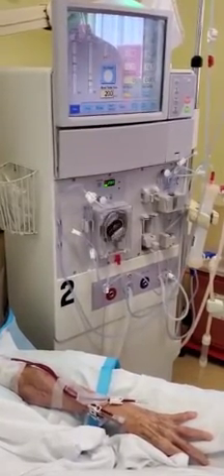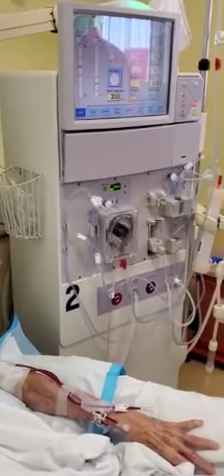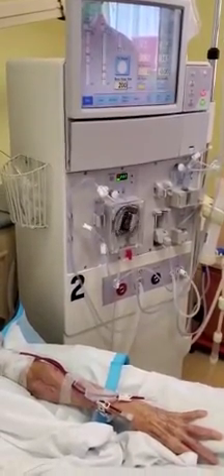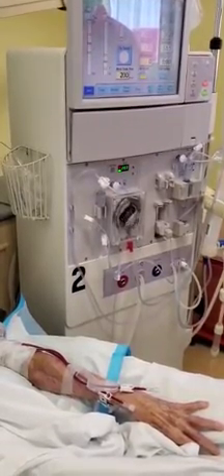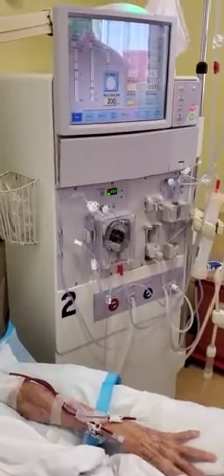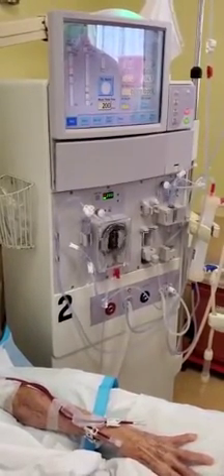Our technician has completed the cannulation of both arterial and venous needles. Both lines are primed, so we are sure that they're in place properly. As you can see, the patient's treatment is already programmed in the machine.